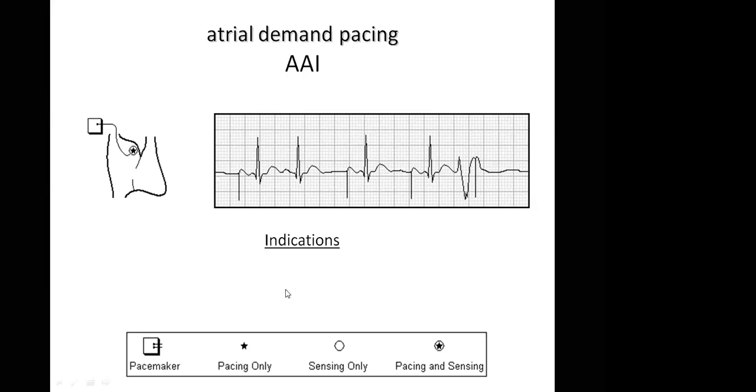Hello, sir. Sorry, I have a concern. The last electrical activity, what's happening there? It seems like it's pacing on what looks like a T wave, not before a P wave. The QRS is not broad. The one preceding it was paced, then you see the P wave, then the QRS complex, then the T wave. After that you see something that looks like a bizarre QRS complex, then you see the pacing entering into that bizarre QRS complex. It means the pacemaker is not sensing ventricular activity. But why is the ventricle coming at that level? Is that a premature ventricular contraction?